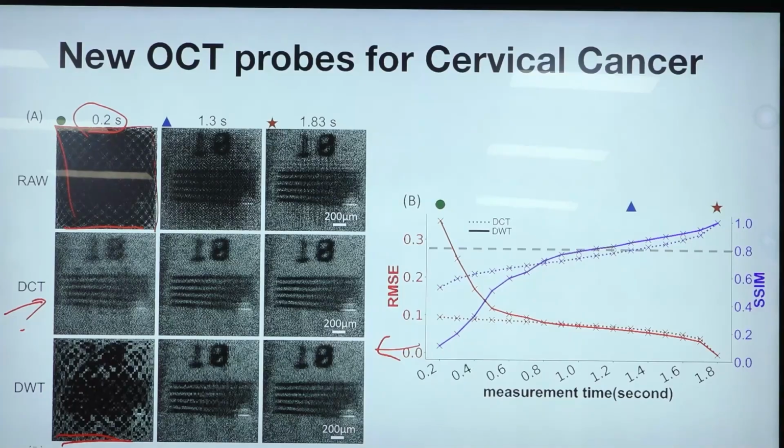The combination of all these things makes this device quite useful. One thing that makes this different from other OCT methods is that it's forward scanning. The doctor can hold the pen and keep looking, and they can get a 3D image of what is in front of the device. That's the essential idea.